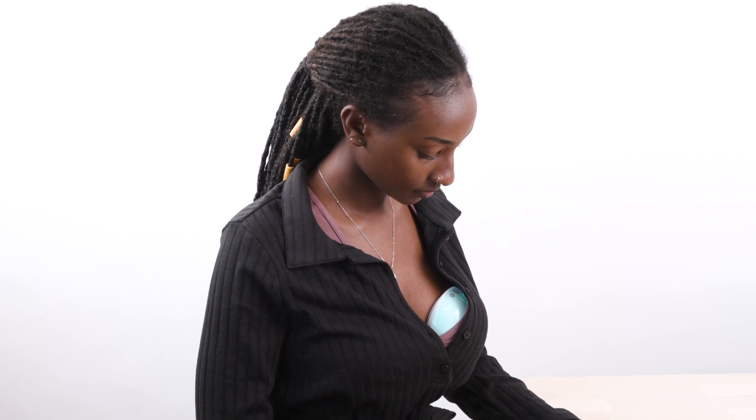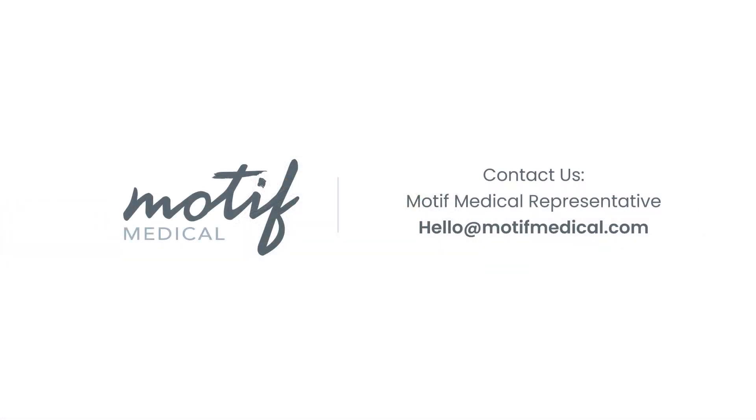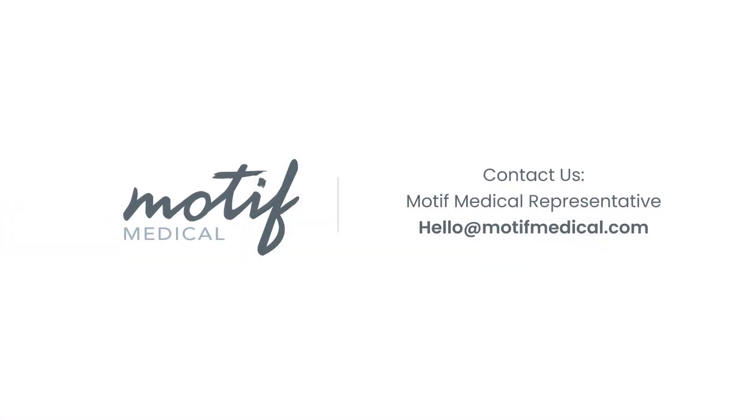It is important to not set the suction level so high that it makes you uncomfortable. If you need any help, please contact our customer service team.